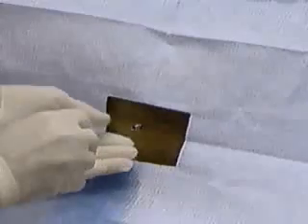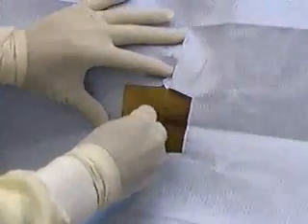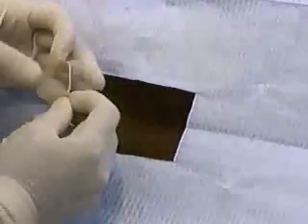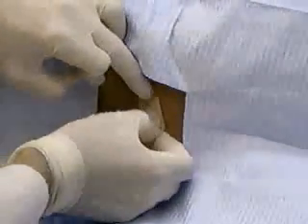Remove the stopcock, replace the stylet, remove the needle. Cover the puncture site with a band-aid.